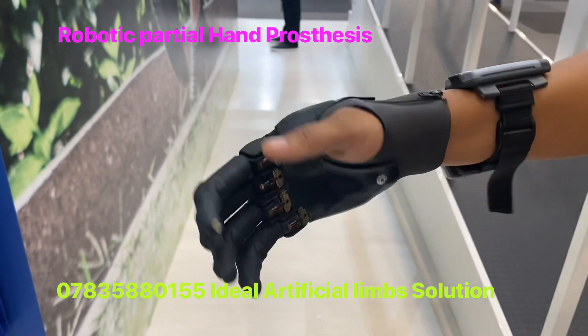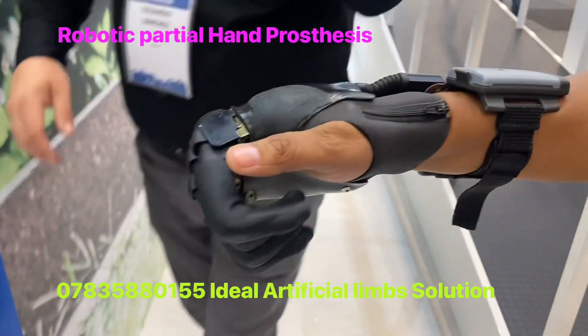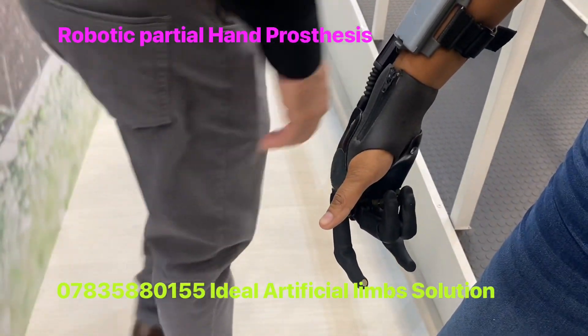All hand movement functionality is possible — there are 24 functions. And there is a gesture control as well.